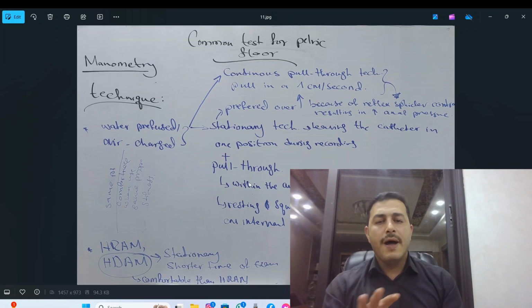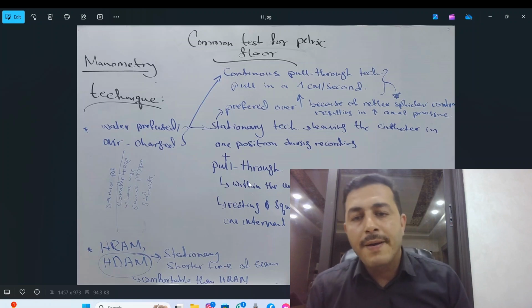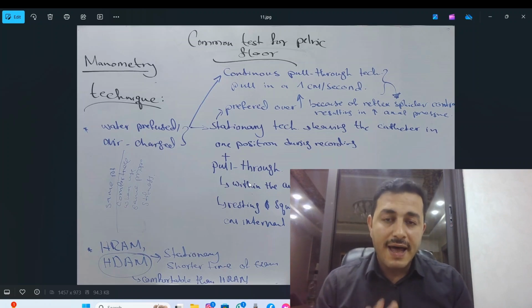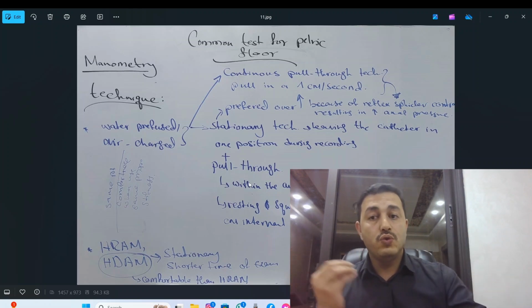We talked about the pull-through technique and how to measure the length of the anal canal. This depends on what type of probe we use.